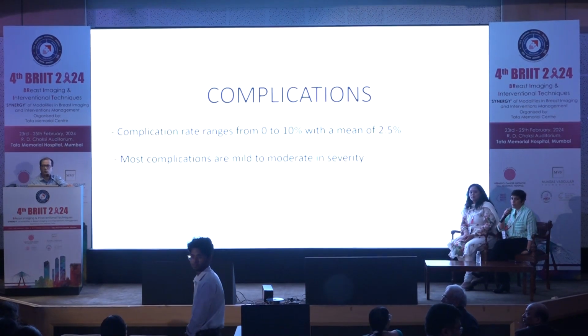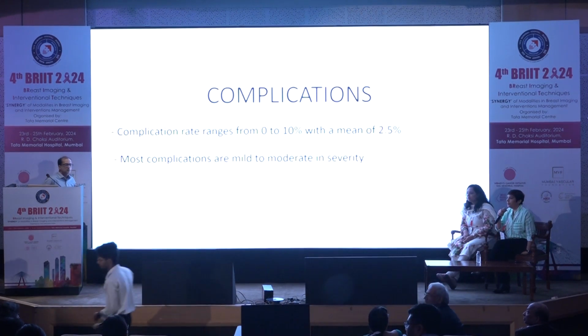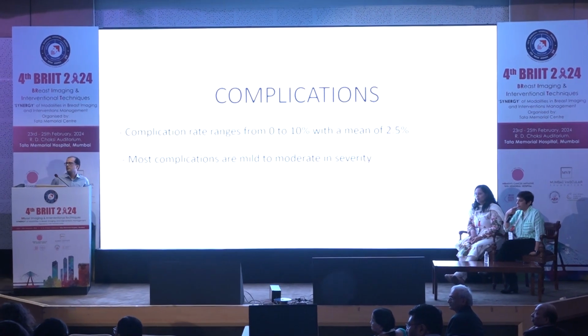Okay. Any more questions? This was an example that you showed, but you wished it's not malignant because you have a CEM. For the listeners, I just want to be very clear that because he did contrast, he was sure it's not going to turn out to be malignant. At the most, it would be a B3 pathology. But if we don't have a CEM, you will biopsy this before you do a wide excision. Yeah, biopsy is a must before that.